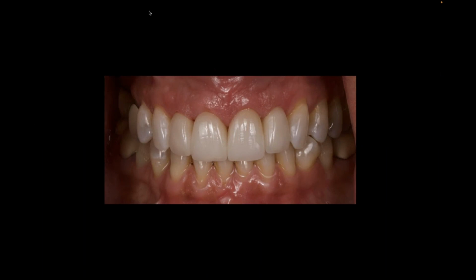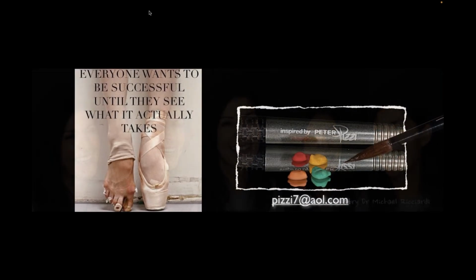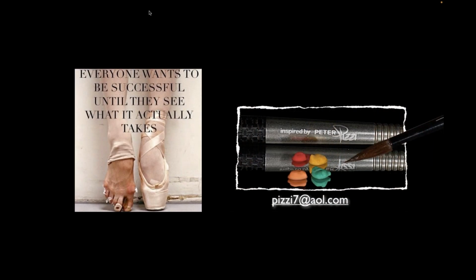So Jim, I hope I fulfilled the task at hand that you asked me for, a simplified shade taking process. I don't know if it's simple. I don't think it is. I think it's really about the two key factors that I said before. Understand what you're looking for first, and you need some documentation to really utilize that. And by the way, that documentation helps you more at the end when you learn to see what you did wrong, what you missed. It's priceless if you can really start to look at your work and say, that doesn't look right. What do I need to change? Do I need more of this or less of that? And how do I make this work in the shade taking process?